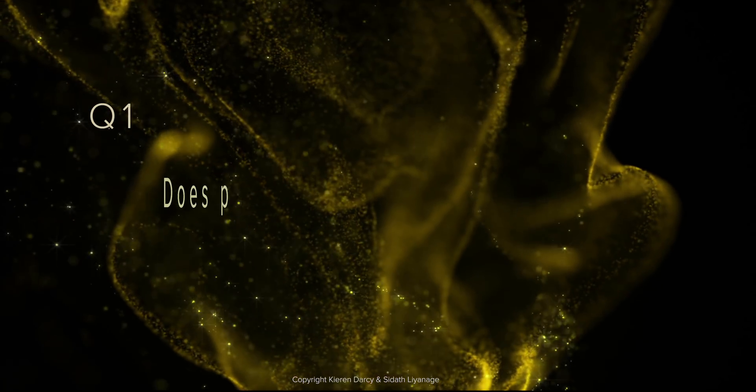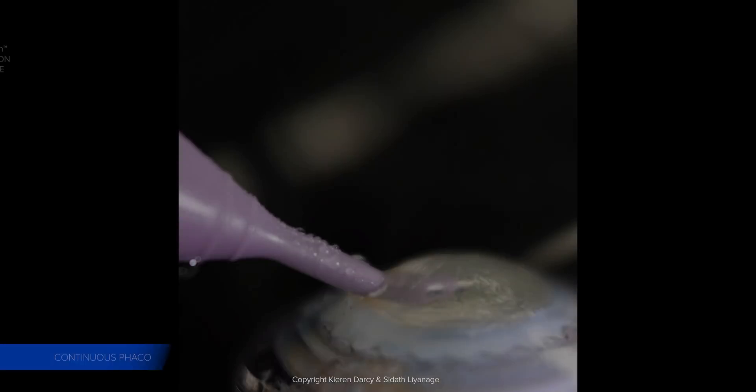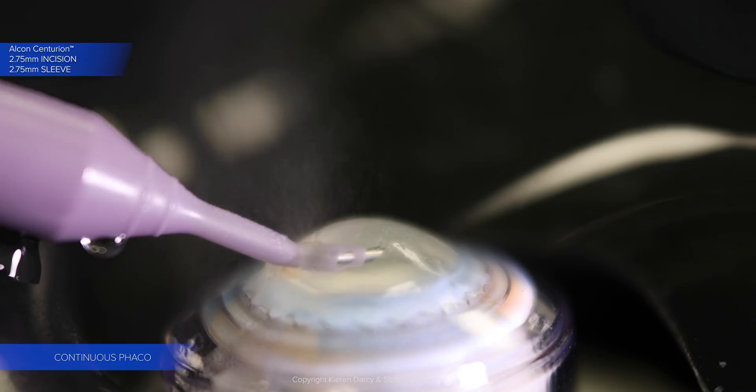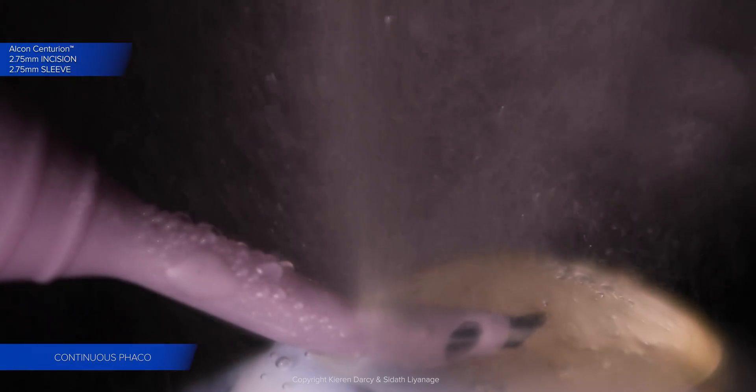Question 1: Does phacoemulsification create aerosols? An Alcon Centurion system is used throughout, here with a 2.75mm incision and sleeve. With the aid of a 4K camera, backlighting and a dark background, the aerosol is clearly visible.